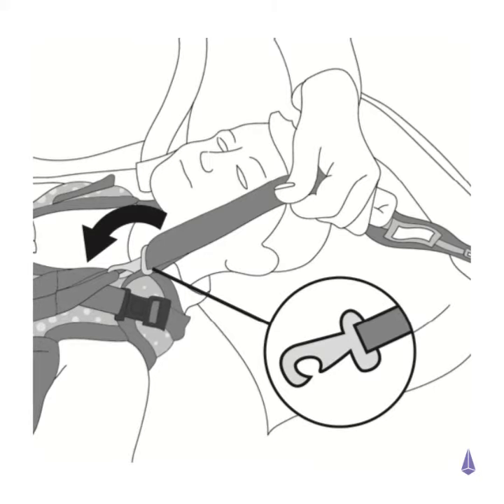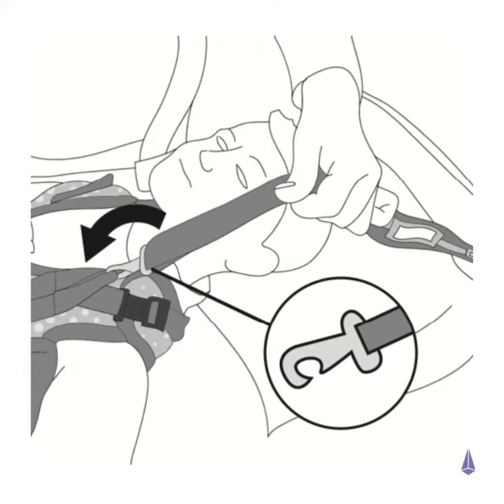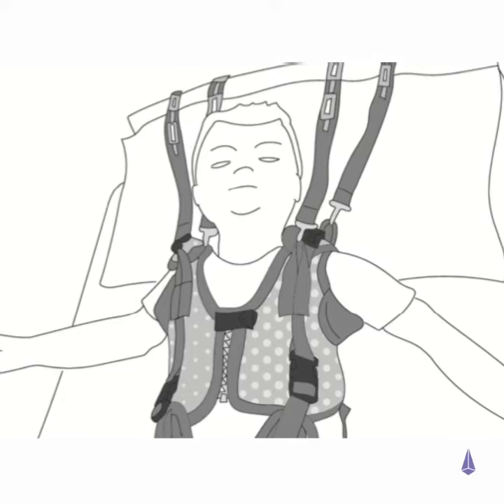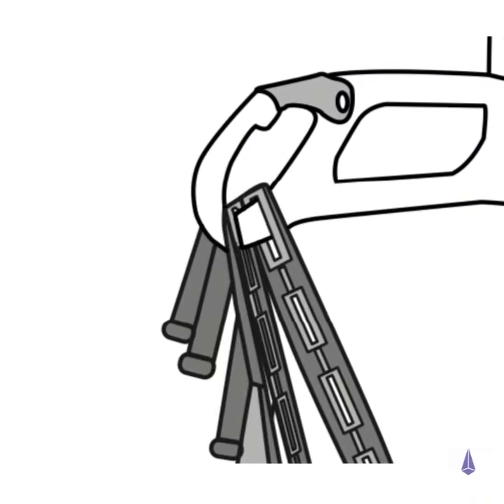Ensure that the webbing loops on the harness are fully enclosed within the stainless steel hook. Please also ensure that the hook is completely closed. Attach all tapes to the hoist.